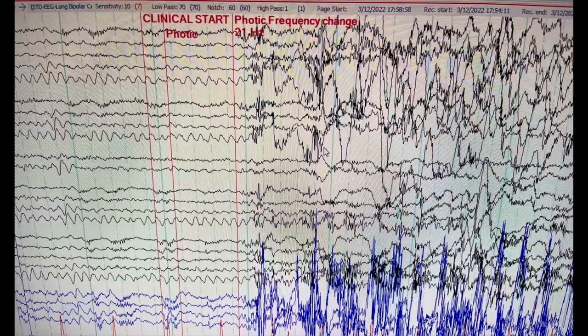This time, rather than an epileptic seizure, this was what is called a pseudo-seizure, or another name for it is psychogenic non-epileptic seizure. This seizure differs from an epileptic seizure in that there are no epileptic discharges on the EEG. You're not going to see any spike and wave discharges or rhythmic buildup of a seizure. You're just going to see a regular EEG, and then once the patient starts their event, you'll see artifact from head shaking or movement. Then it immediately returns back to normal with no slowing after the event — and that's exactly what happened today.